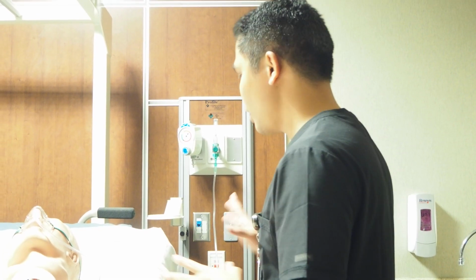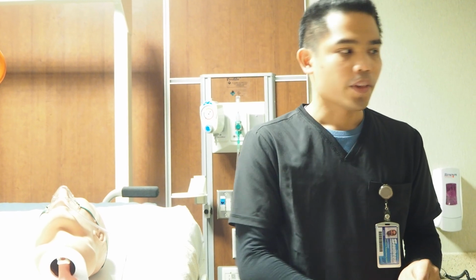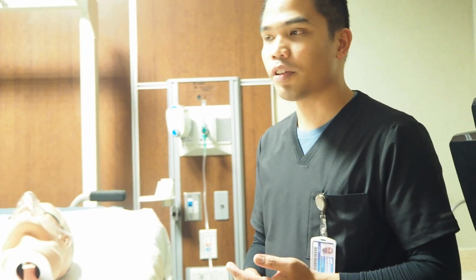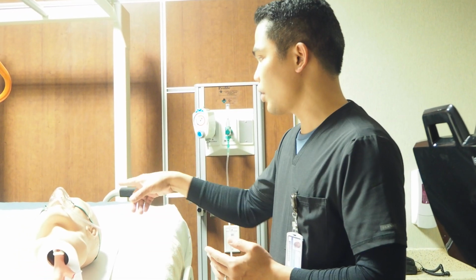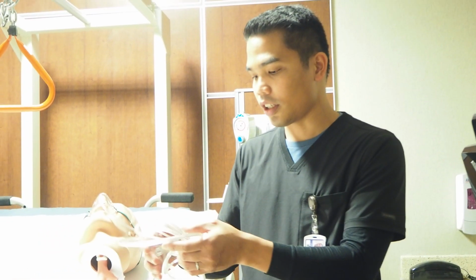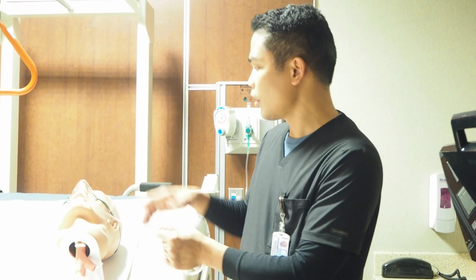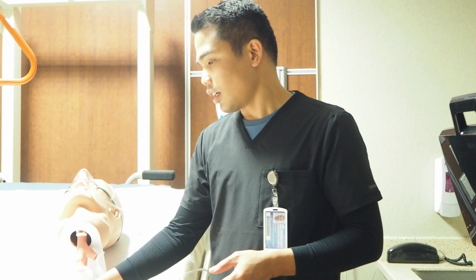So after doing the whole patient assessment, I will always ensure to wash my hands and then document everything, and then explain to the nurse station or the physician that the patient was doing well, especially with the simple mask compared to the nasal cannula. Also, the nasal cannula should be put in a safe, clean container, just in case we shift from the simple mask back to the nasal cannula. And I think that's all.